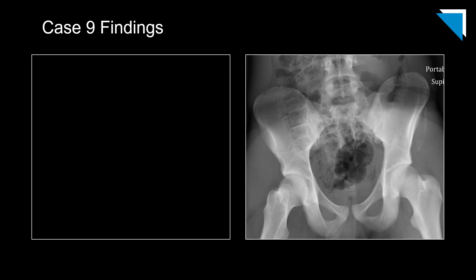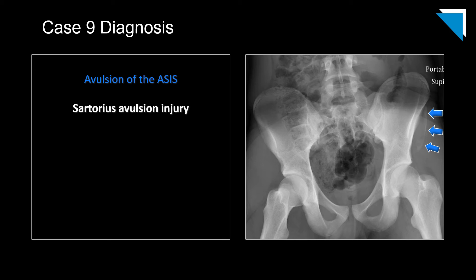This next image is a companion case: a 15-year-old boy with left hip pain. Here is an AP view of the pelvis — if you take a moment to review all the landmarks we just discussed, the finding should be apparent. This is an avulsion injury at the sartorius origin. Note how large the osseous fragment is in this case relative to the last one.